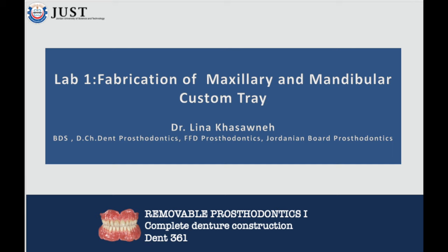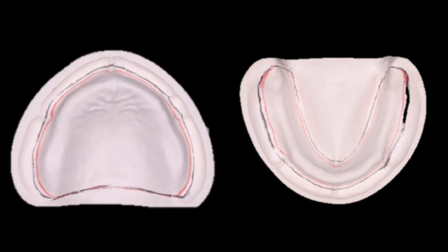In the last video, you learned how to make a primary impression for an edentulous patient using impression compound. The impression is poured with type 2 dental stone, and the cast is allowed to dry out completely to prepare for the fabrication of the custom tray.